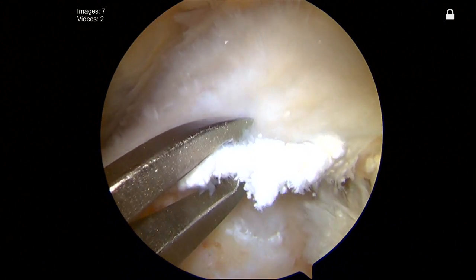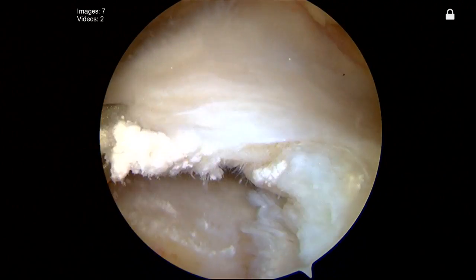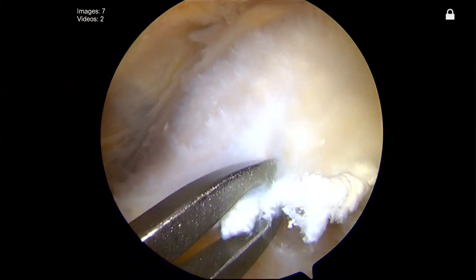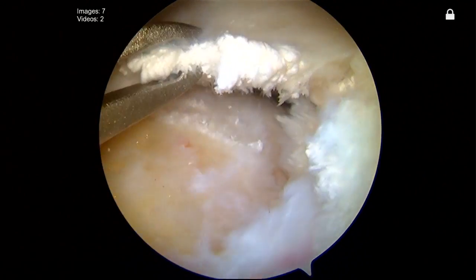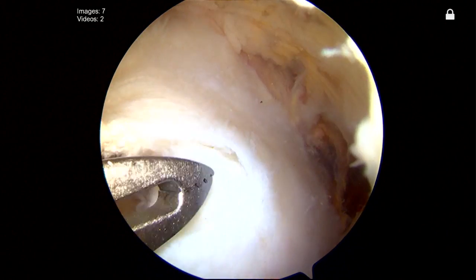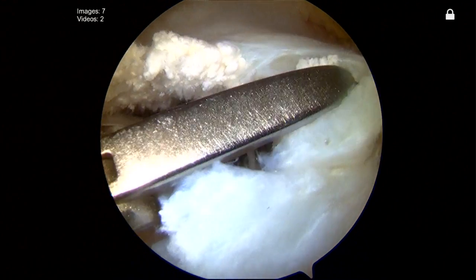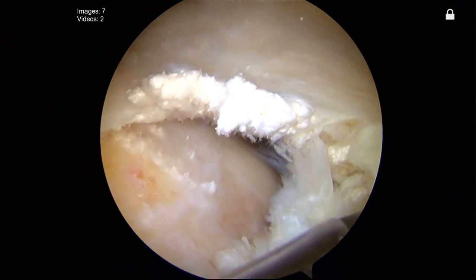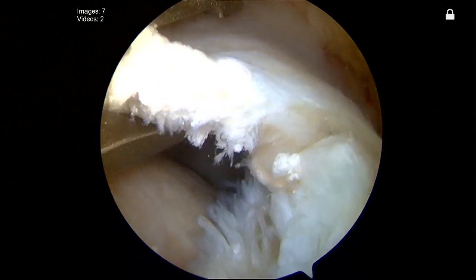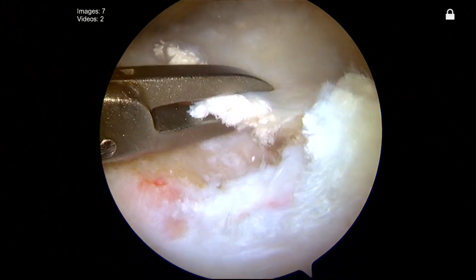One of the things that we talk about frequently, Tony, is to evaluate the identity of the tear itself. In most cases we'll find that we either have a small crescent tear, but as these tears get larger they often form either an L or a reverse L type tear. In this situation, you can see that she's evolving a split between the supraspinatus and the infraspinatus. There's some fairly significant degeneration of the tissue here. This is the leading edge of the infraspinatus, and here's the supraspinatus — so this is really an evolving reverse L type tear.